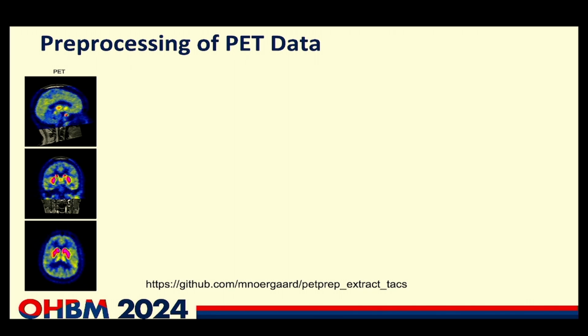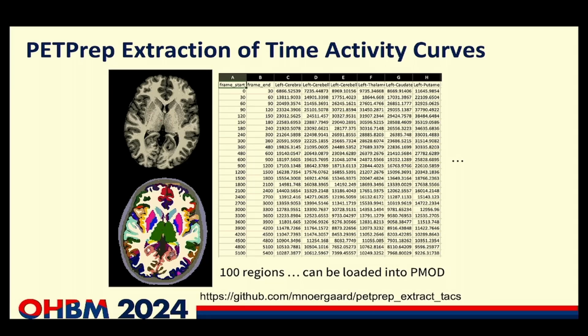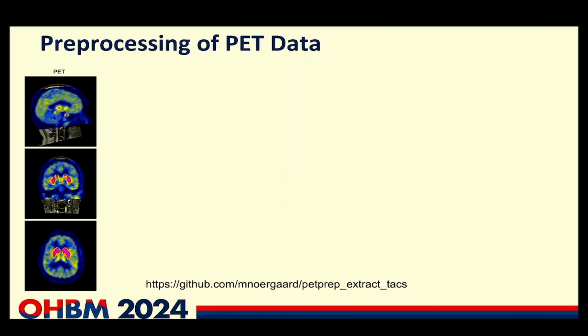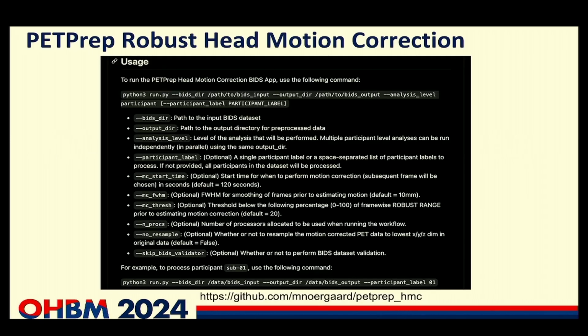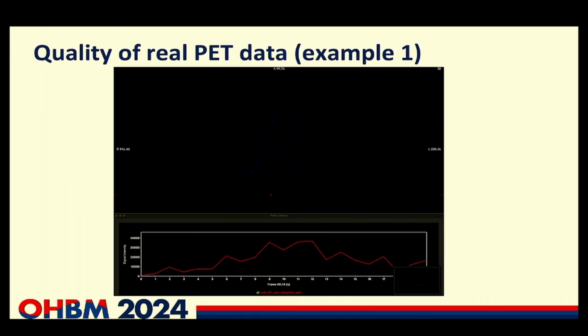If I may add something, for the sake of the audience, partial volume effect correction is a means by which to reduce bias in the data, but while introducing variance. So if you have a young set of subjects and a diagnostic group, for instance, where you don't expect any volumetric differences, partial volume effect correction could well make your data worse.